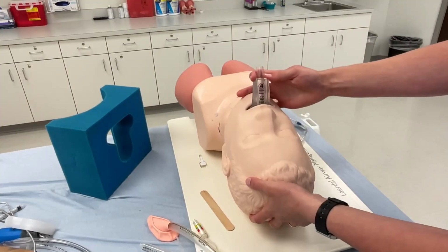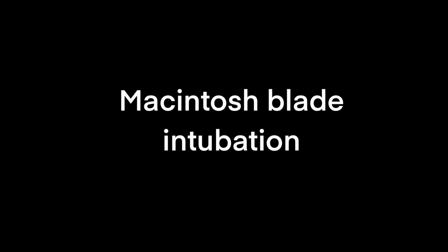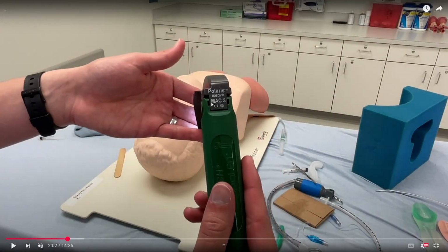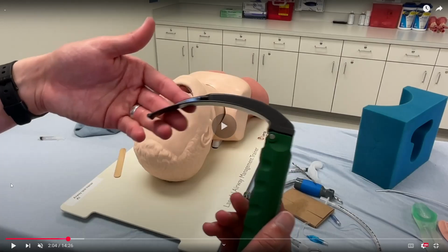And there you go. And now for a Macintosh blade intubation, aka a Mac blade. And I'll show you that. And there we go. Mac 3. So Mac is the style, 3 is the size. And the key thing to note about this is the curvature of the blade. Millers are straight, Macs are curved.